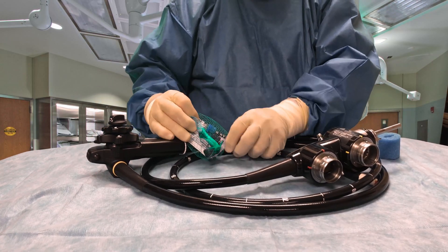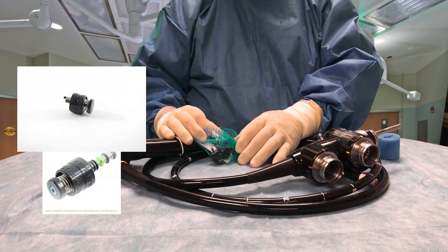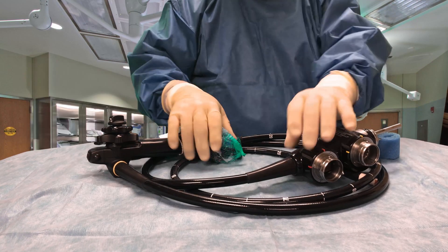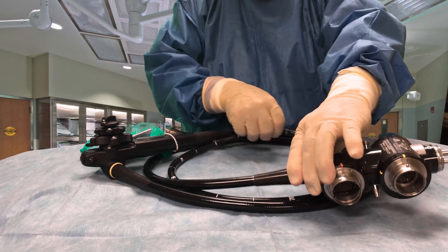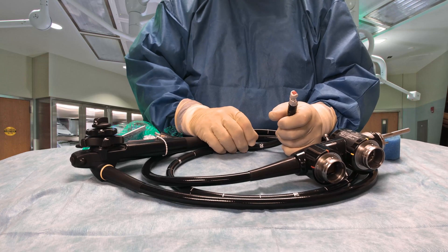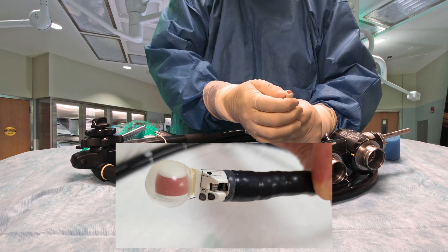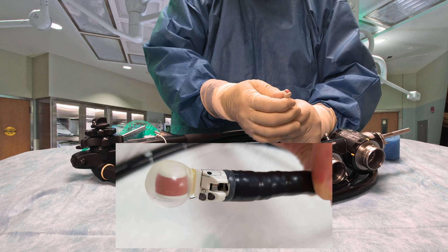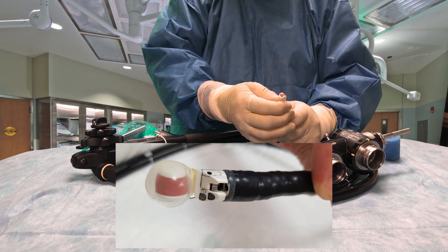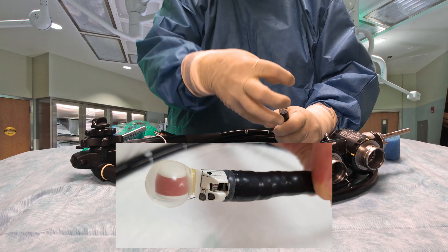It uses different types of valves — I can't really show them here because they're in this basket — but these different valves are used just for ultrasound scopes. The other thing we do differently with a linear scope and a radial scope compared to regular endoscopy scopes is there is a balloon placed over the top of the transducer portion. This balloon is inflated with water, so it's like a water balloon hanging on the end of your scope.